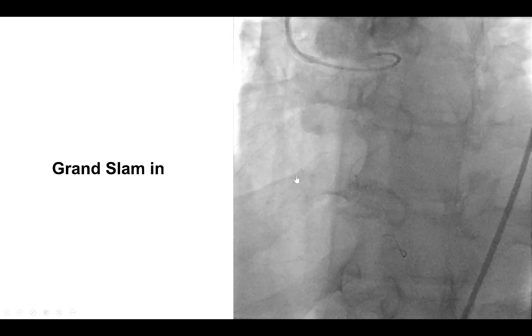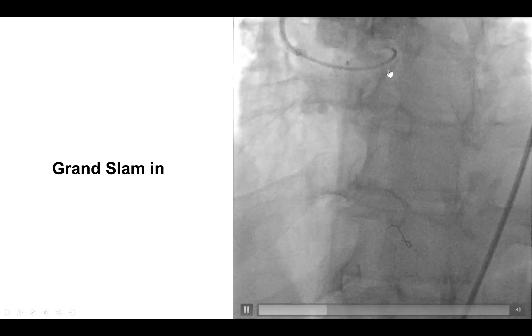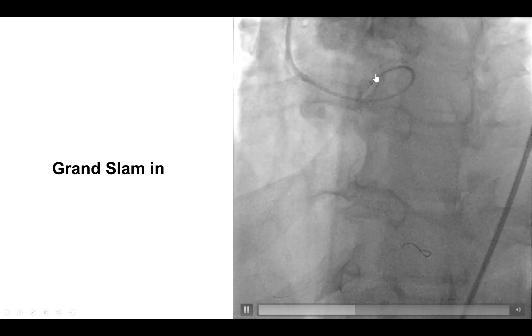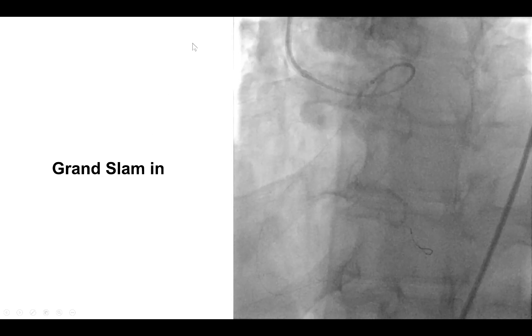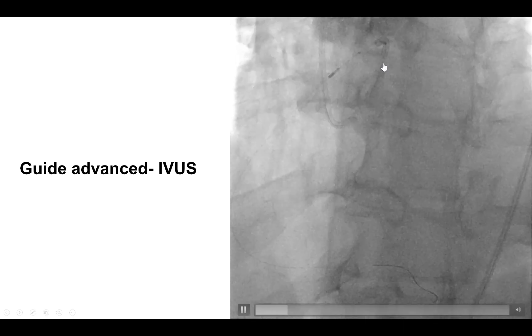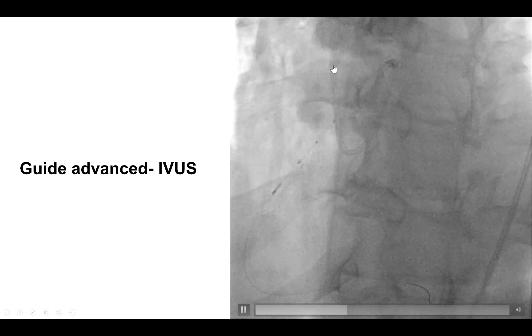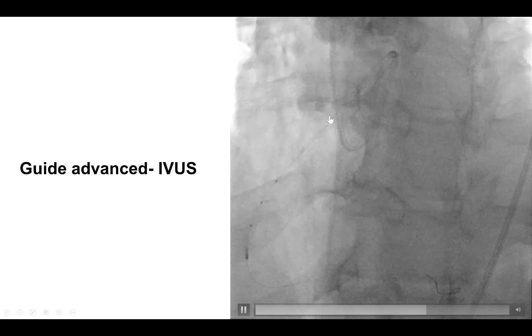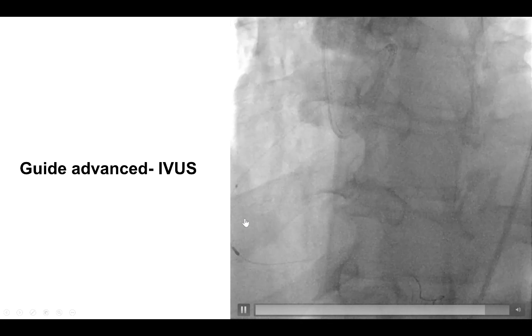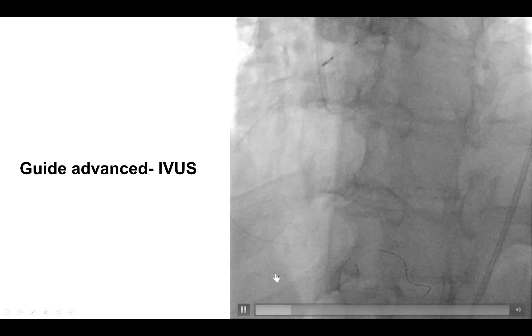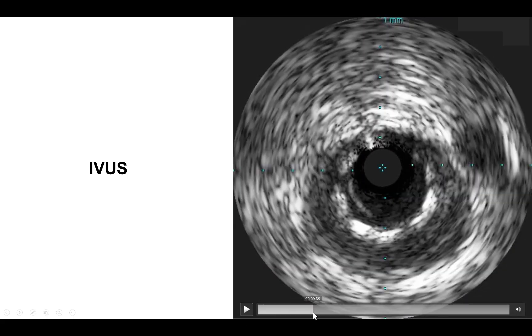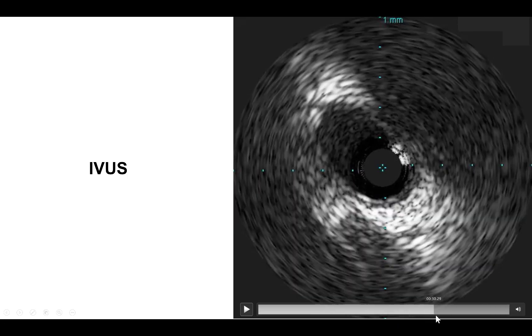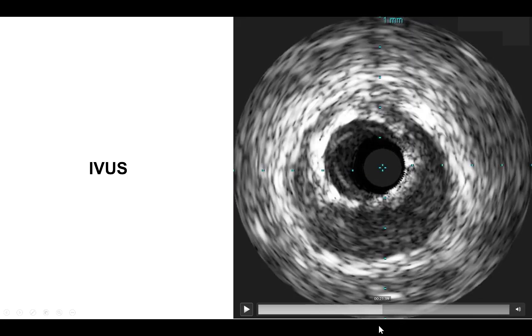We wanted to perform intravascular ultrasound, which unfortunately would not fit through the six-French guide extension. So we switched the guide wire for a Grand Slam, which is a highly supportive wire, then removed the guide extension and pushed the guide over the wire — which assumes a peculiar form — but then successfully engaged the right coronary artery. We were able to advance the IVUS all the way to the distal RCA to check the result. The stents were well expanded; there was indeed an aneurysm at the area of stenosis, but the stents were well expanded with a nice result all the way to the ostium of the right coronary artery.